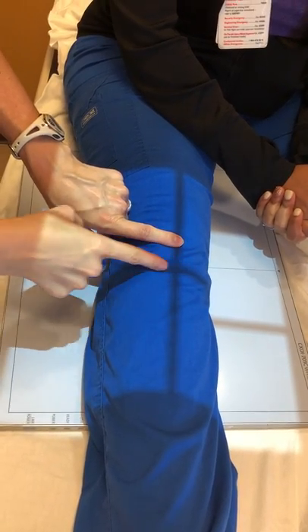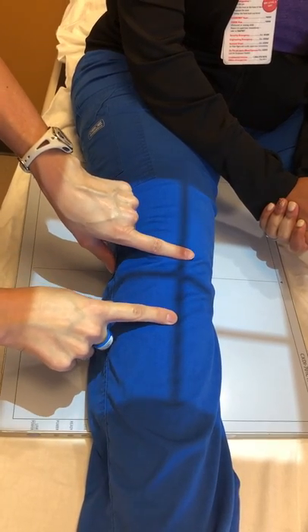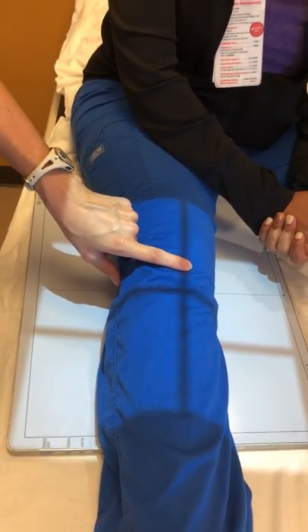One-half inch distal, or below, the apex of the patella is where you will place your central ray. This crossbeam from the collimator light goes one-half inch below the apex of the patella, which is the most inferior aspect of the patella itself.